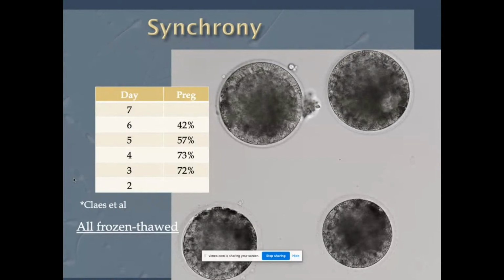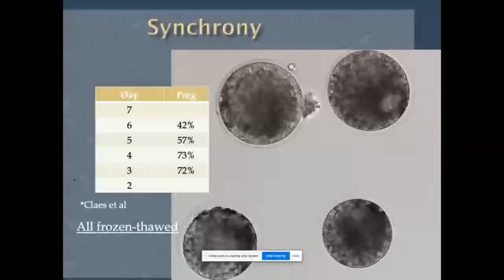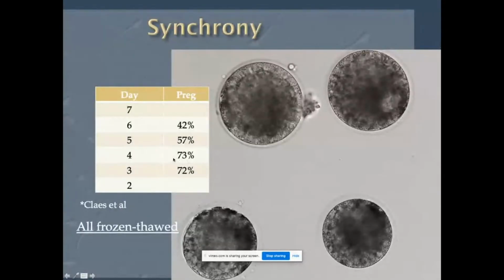We found over the years that when we thaw the embryos and put them in culture medium, which of course is inferior to the uterus, it allows us to see them expand and start growing relatively quickly, within hours. The others may take a day or even 2 days. And so my guess is that some of these later results and improvements are due to those embryos that were slow in recovering from the freeze-thaw process.